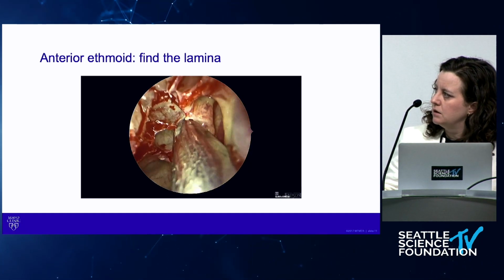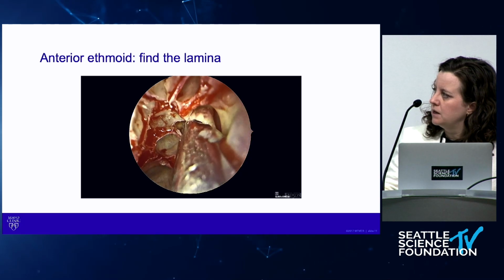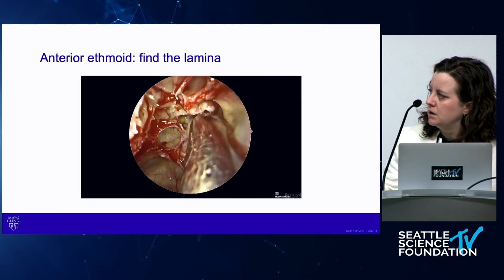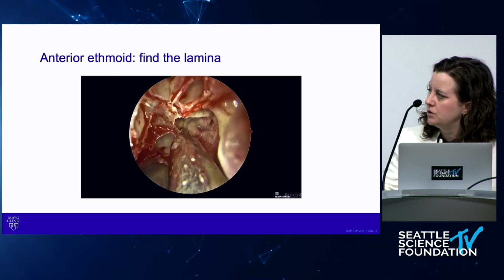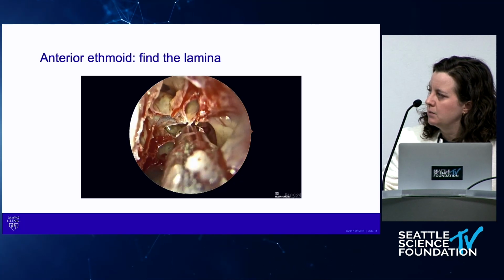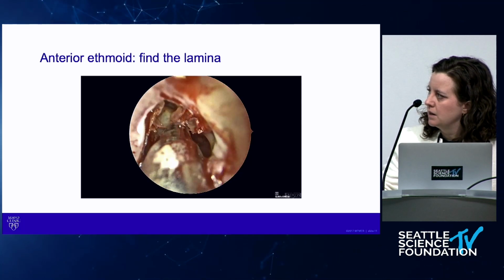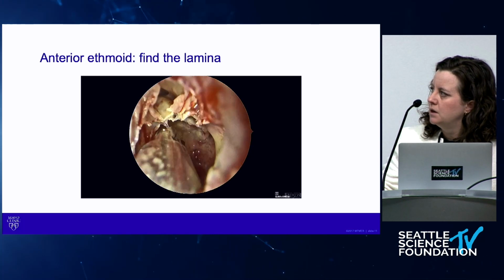The other thing about taking off the bulla, you want to make sure you get the whole medial side. I sometimes see patients, I'm revising their surgery, someone has gone right through the middle into the basal lamella, but they haven't removed this medial wall of the bulla, so you want to make sure you get that whole bulla off. You want to completely expose it over to the lamina. You've got your maxillary sinus down here, your lamina is fully exposed, you're going to see the basal lamella here. You can start to take this upward towards the skull base.